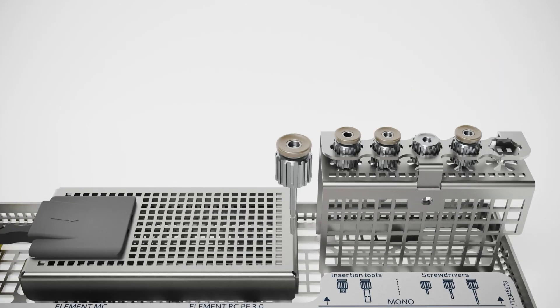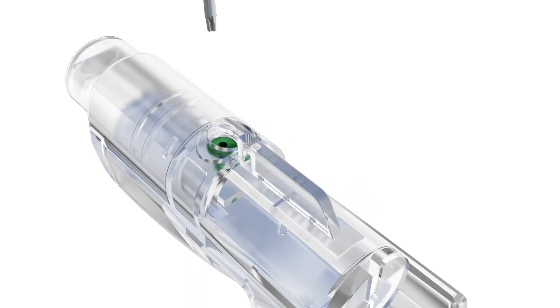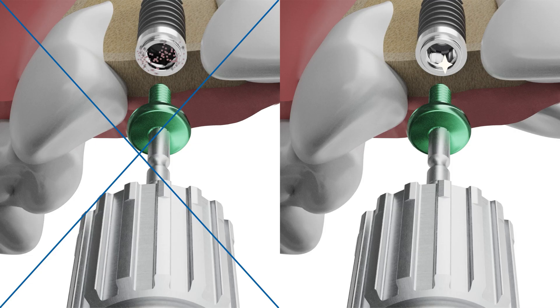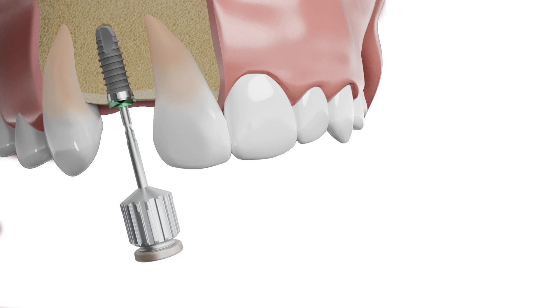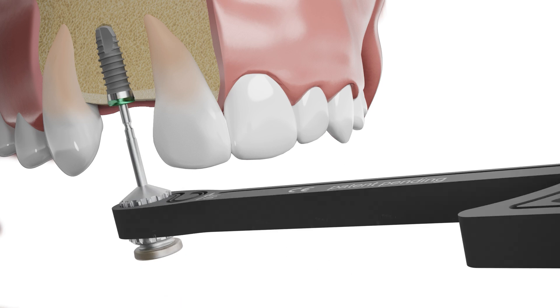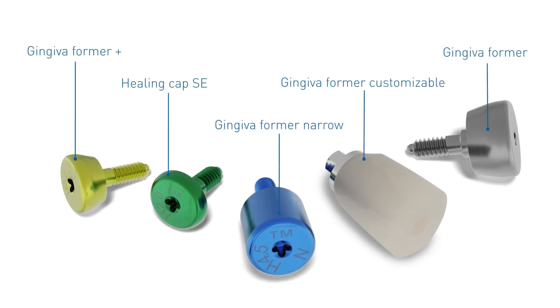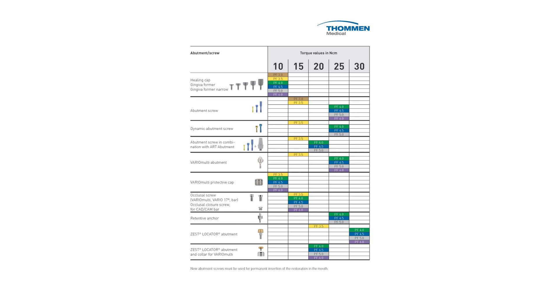If you wish to insert the healing cap, twist the cover of the ApliQuik container and engage the healing cap with a mono screwdriver. Ensure that the interior of the implant is clean and free of blood to enable proper closure. Screw in the healing cap by hand until it is in slight contact with the implant shoulder. For final tightening, use the torque ratchet with the indicated maximum torque of 10 newton centimeters. Tomin Medical also offers various types of gingiva formers and a wide range of temporary and final abutment solutions for restorative flexibility. Make sure you do not exceed the indicated torque values on the provided torque value chart when using the universal mono screwdriver.